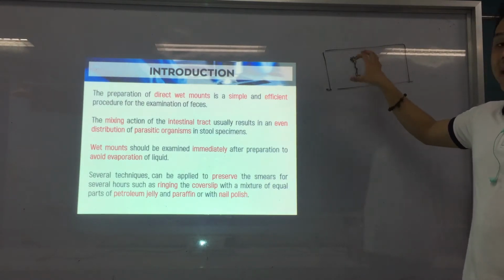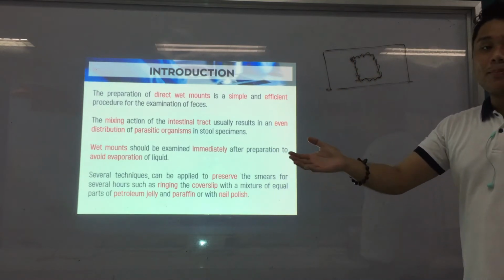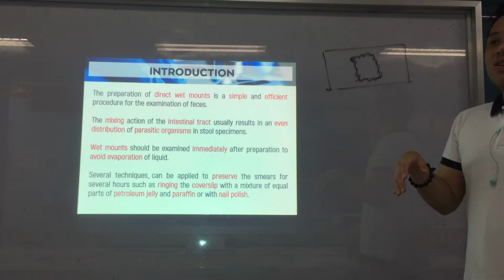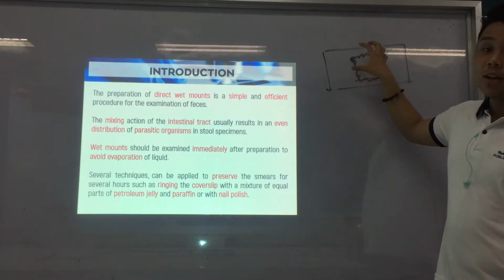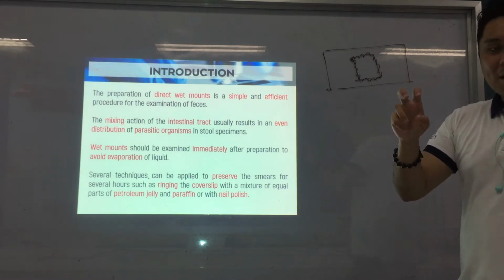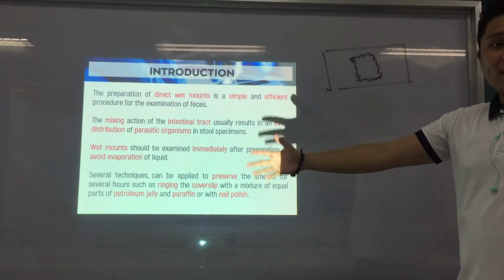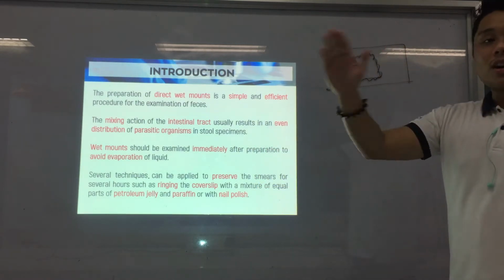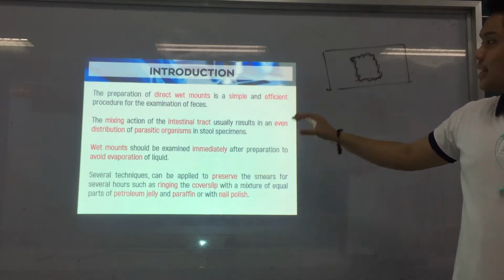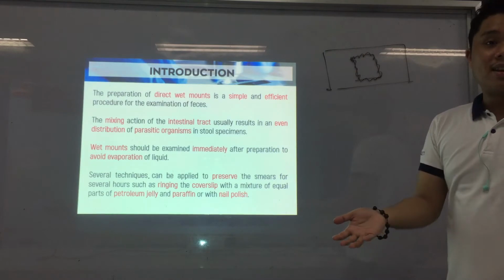The main purpose of ringing the cover slip is so that the cover slip will stay put, so that it will not move. Because the cover slip is already secured, locked in a way by your nail polish or petroleum jelly, you can look at your smear again at a later time, because the cover slip has already been secured.